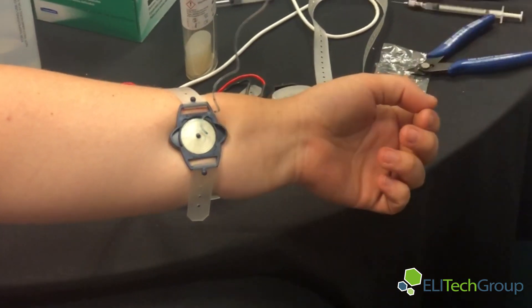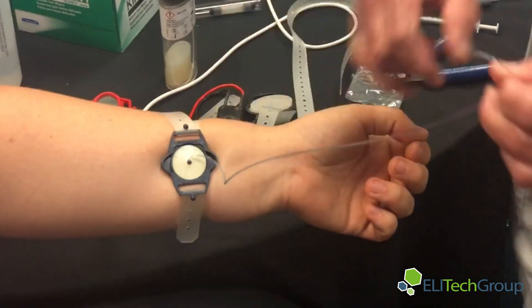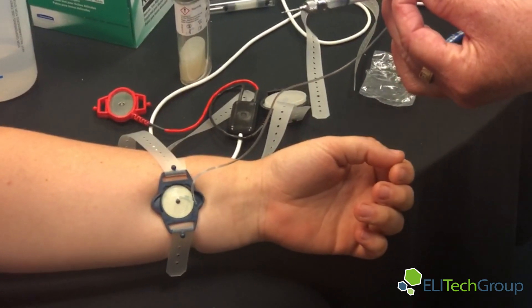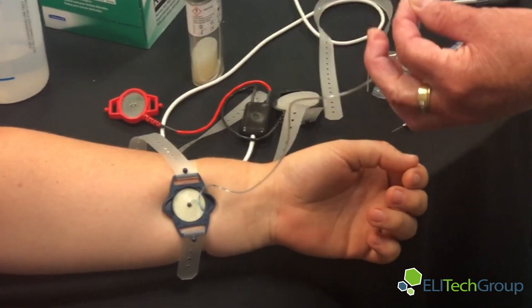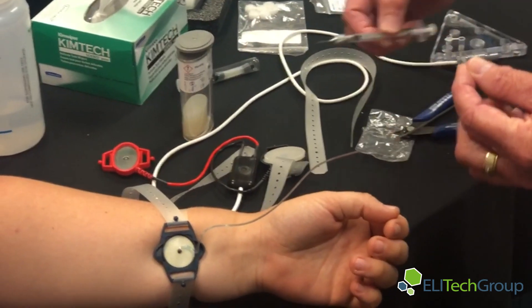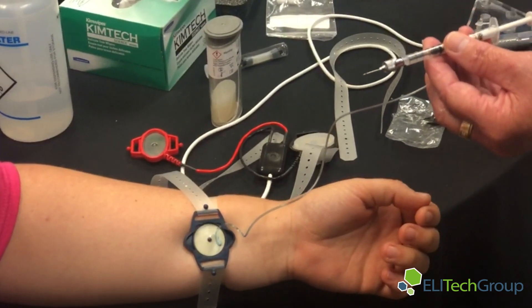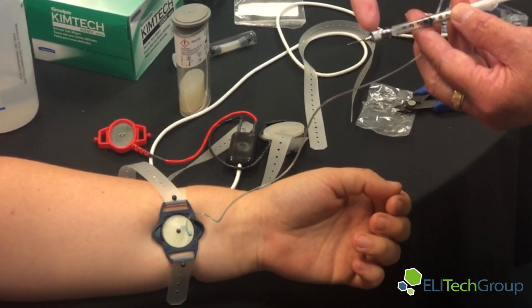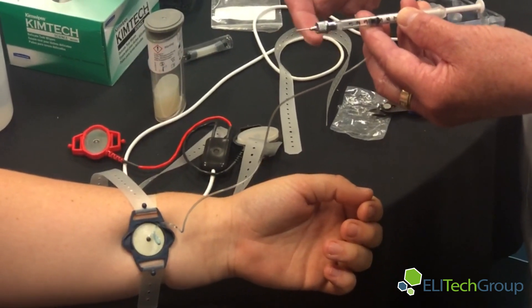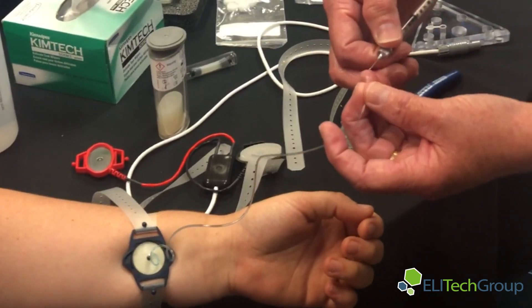There are two ways to remove the sweat from the arm. You want to make sure you're collecting all the sweat on the back of the arm. You can either use a syringe, which I prefer and find easier, or you can use the sweat collection tool that comes with the kit. In the MacroDuct Advance kit, it comes with syringes and also these tapered metal needle tips. You don't want to throw these away — they are not disposable. The syringes are, but these are not. The tapered ends make it very easy to fit into the micro-bore tubing.